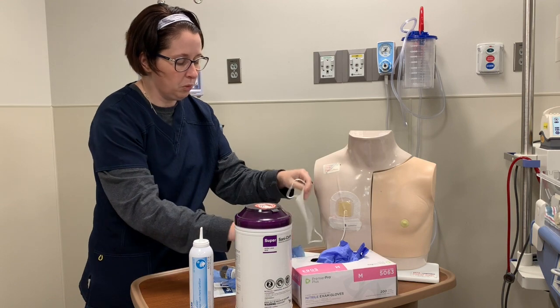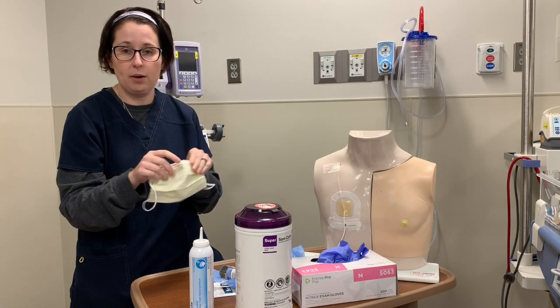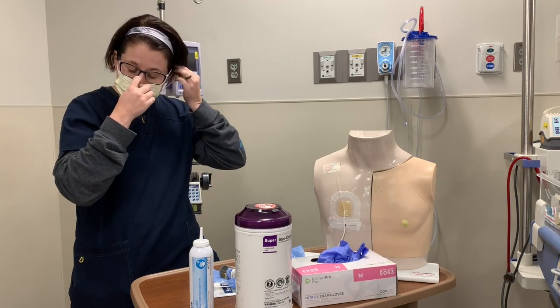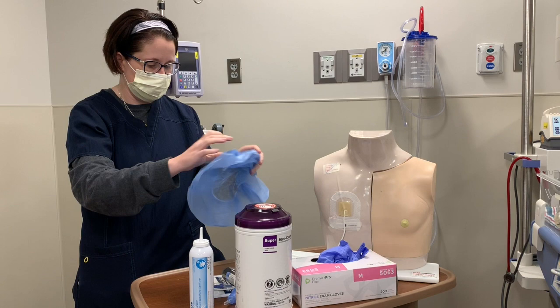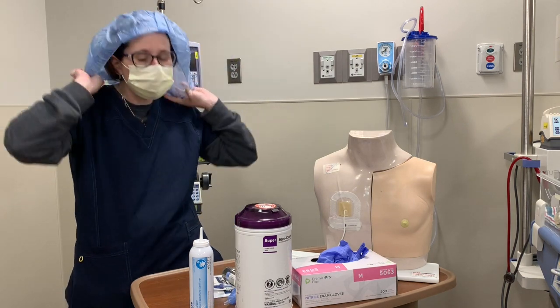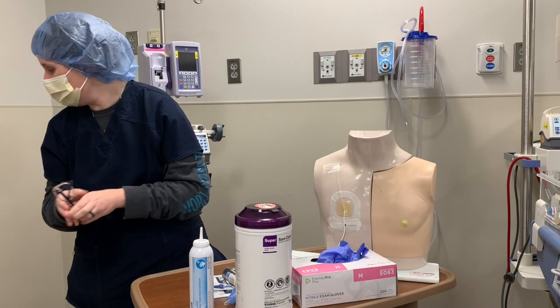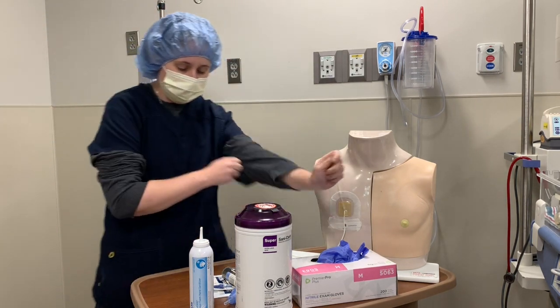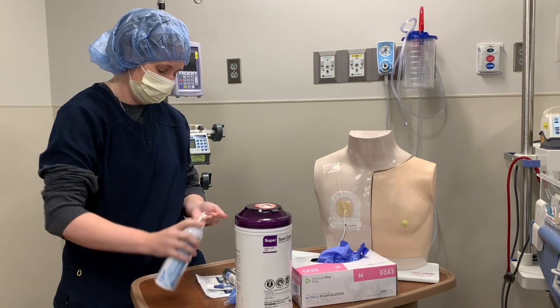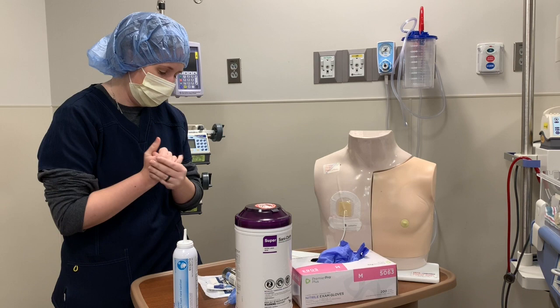Some supplies you'd want to bring in include a mask — when I'm getting closer to doing the procedure, I'd put a mask on. My hair is slightly pulled back, but I'm going to put a bouffant on because it's a little free-hanging. And I'm going to take my glasses off because they're going to fog up.